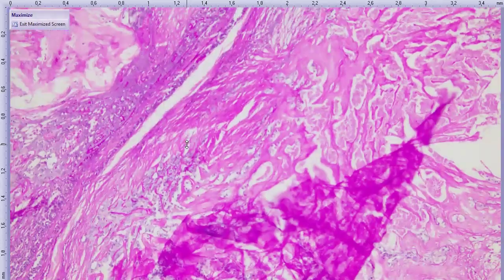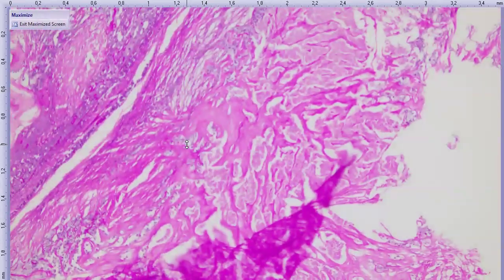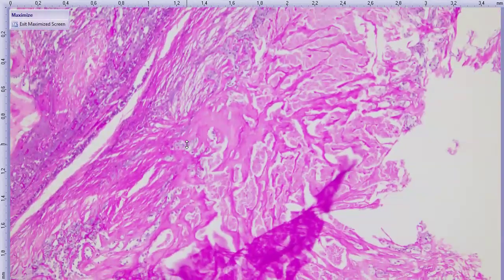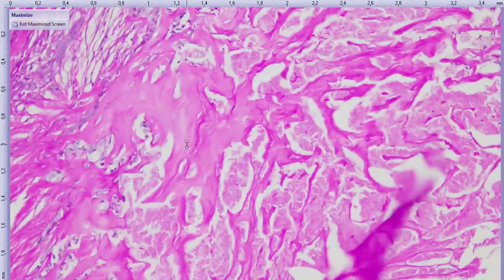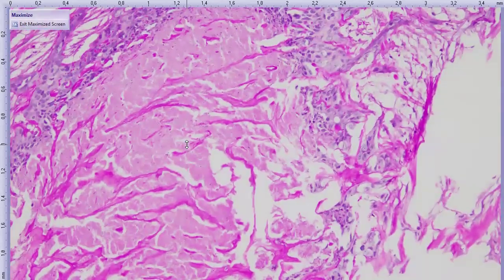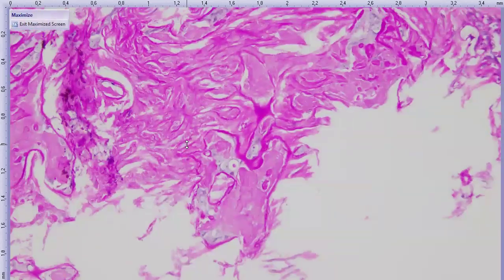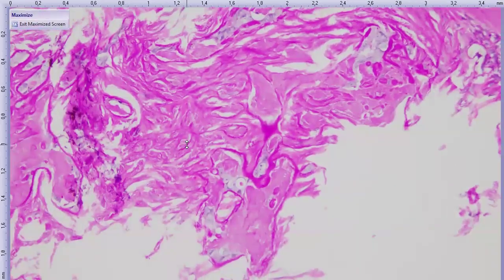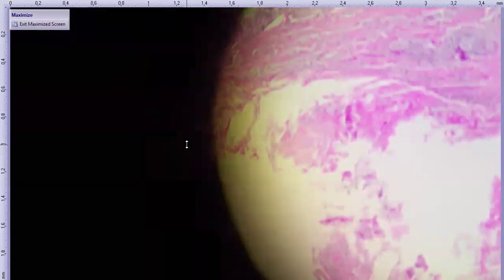Another useful thing that we can do is look at these areas of necrosis, right? Basement membranes are extracellular matrix, so they don't die. You can't kill what's never been alive. The cells here are all dead, but if you look at the areas of necrosis, you can still see the leftover scaffold of those basement membranes, which confirms that all the necrotic tissue was once the neoplastic population.